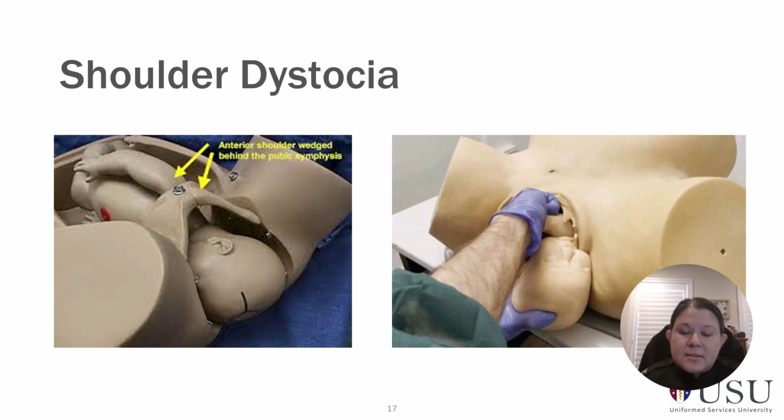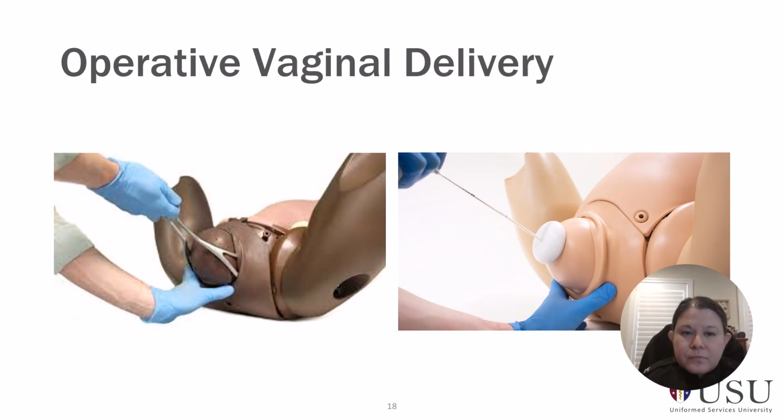There have been randomized controlled trials and studies looking at skill attrition related to shoulder dystocia and have definitely shown a benefit with practicing and shoulder dystocia simulations in improvement in neonatal outcomes. And in fact, many insurance companies will actually give a discount for providers that have completed simulation training because of the benefit. There are also simulators that include a traction device in the fetal shoulder and neck. And then you can actually measure and show people while they're doing the simulation how much traction they're putting on the baby's neck. So again, a really effective way at improving outcomes and improving training in obstetrics and gynecology.